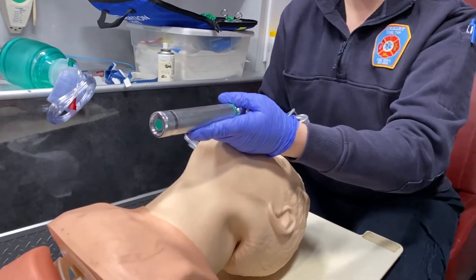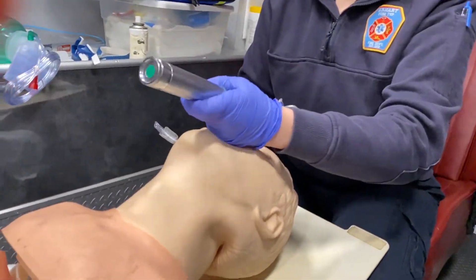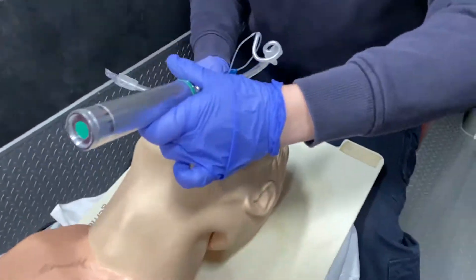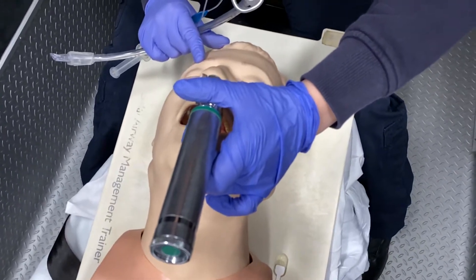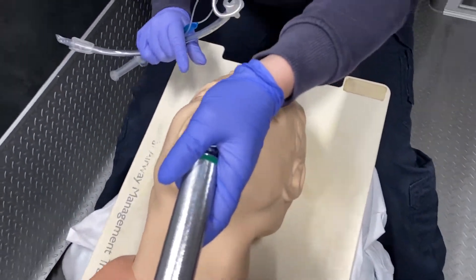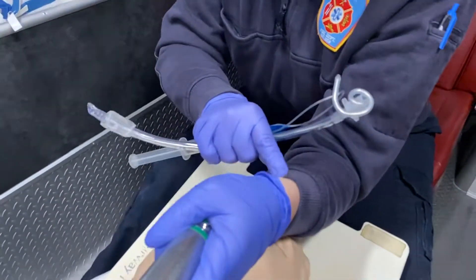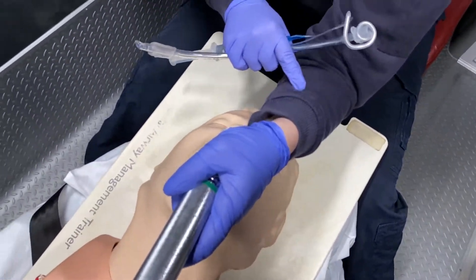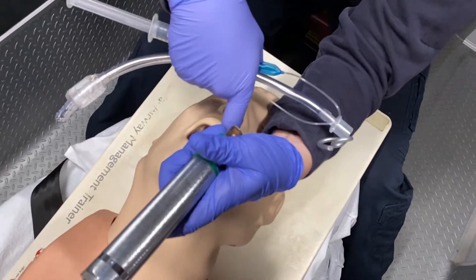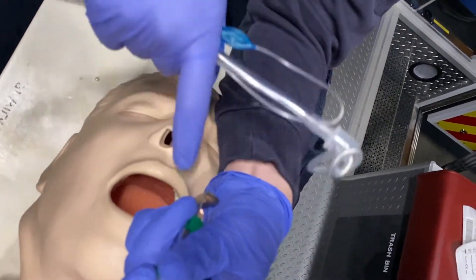Now this is where a lot of people get in trouble. They try to move the laryngoscope back like this to get a good visualization of the airway, but as you can see I'm hitting the patient's teeth — and we don't want to do that. So what I do is hold my laryngoscope down here and push up and out. I use my forearm to hold the patient's forehead back, and I can actually stick my finger between the laryngoscope and the patient's teeth.